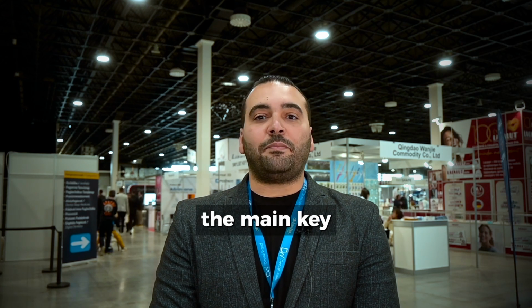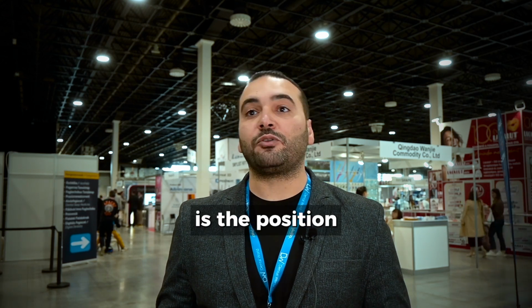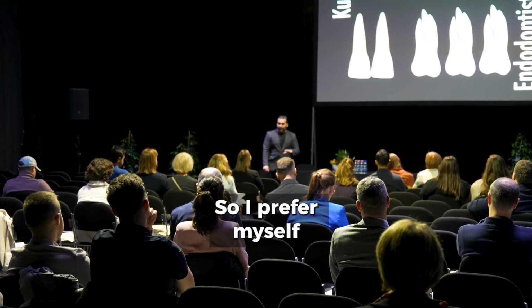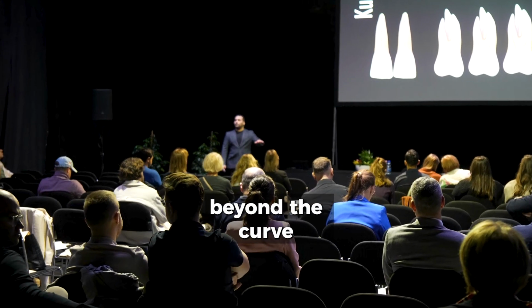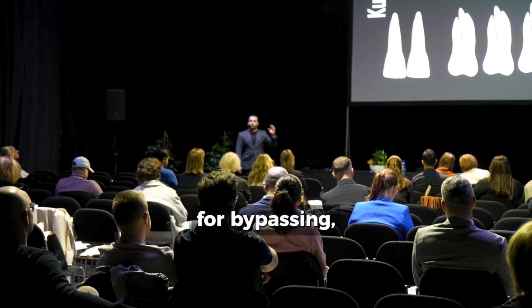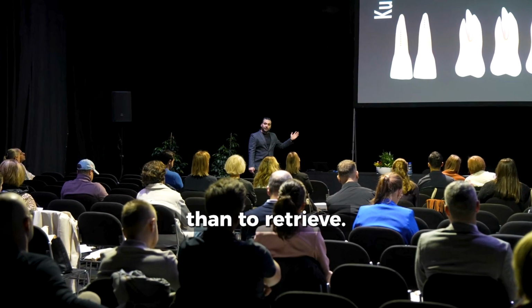What do you think are the key clinical factors that determine whether a broken instrument should be bypassed or retrieved, and how can these be evaluated during treatment planning? Actually, the main clinical key to bypass or to retrieve is the position of the broken instrument. I prefer, if the broken instrument is completely beyond the curve, to go for bypassing, which is more conservative than retrieving.